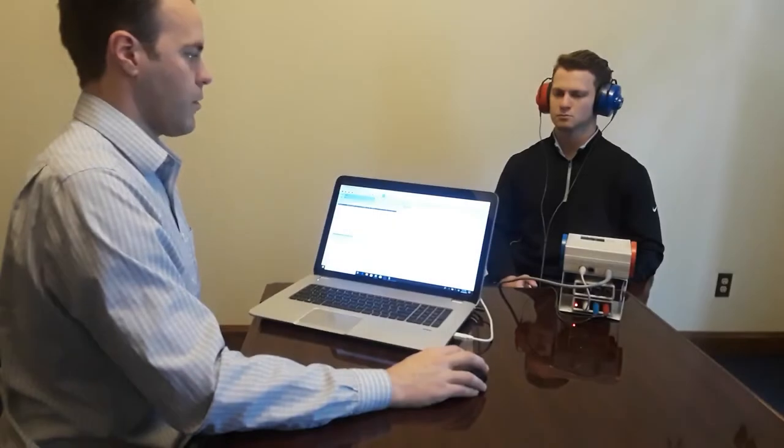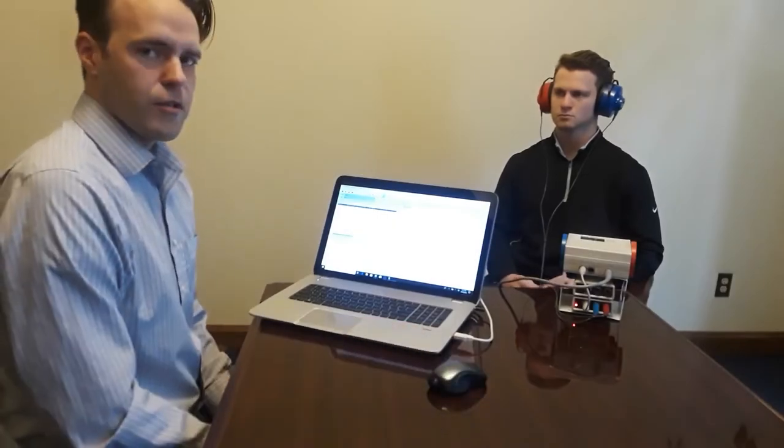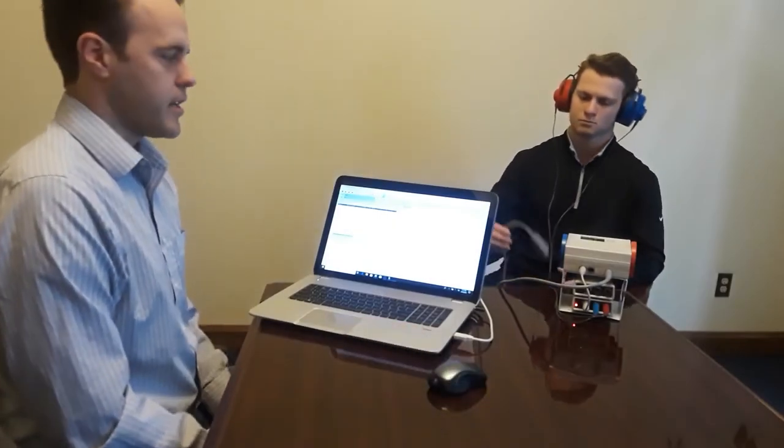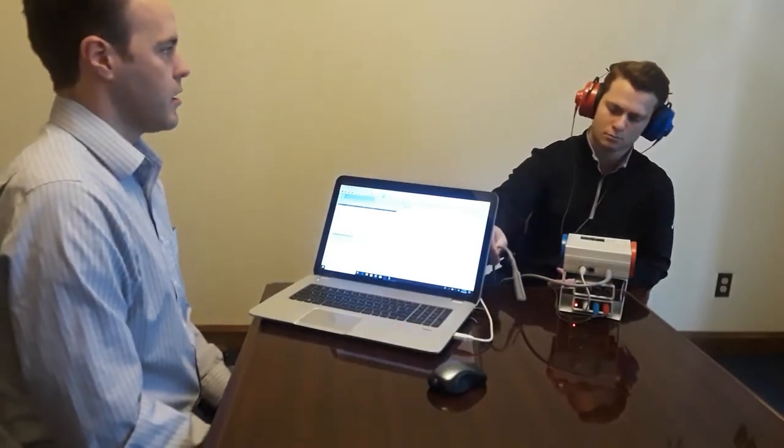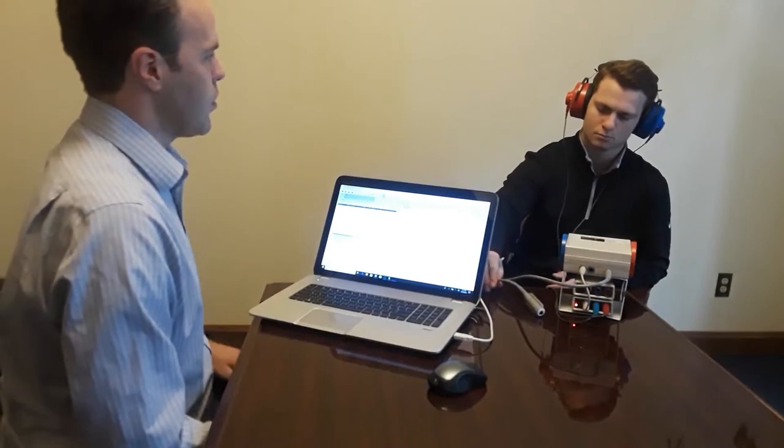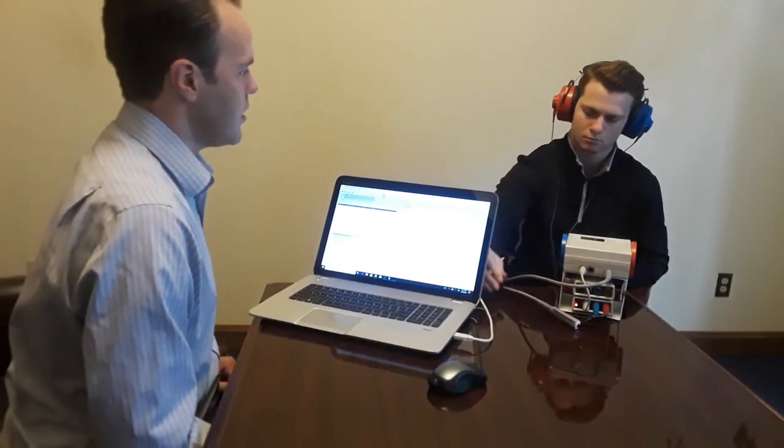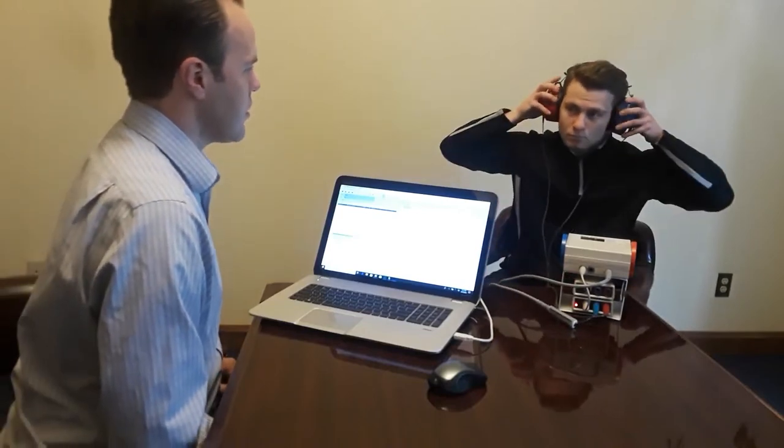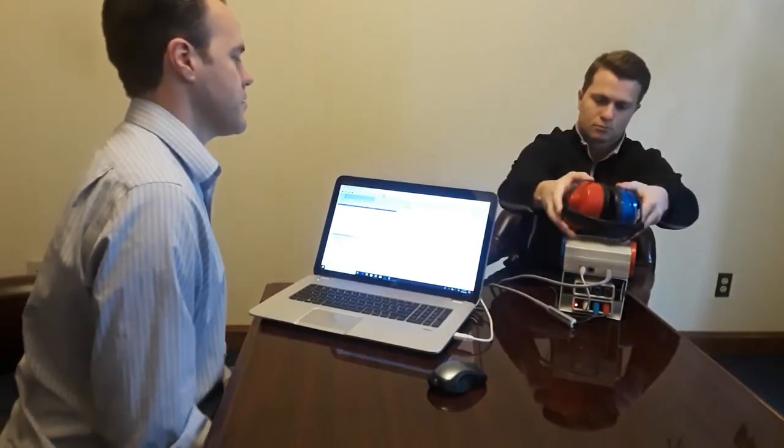All right, Nick just concluded the unoccluded portion of the test. You can remove your headset and insert your hearing protection device.